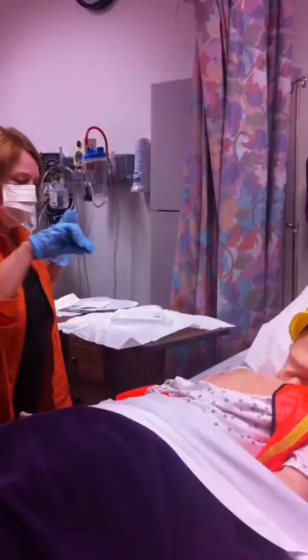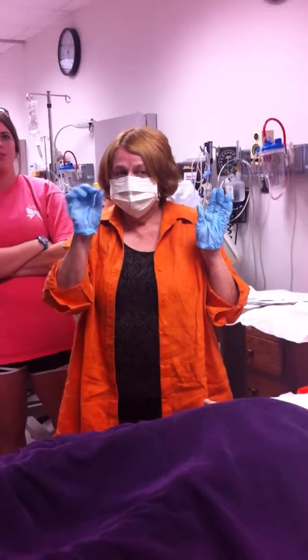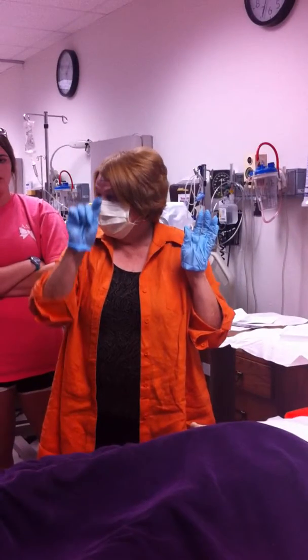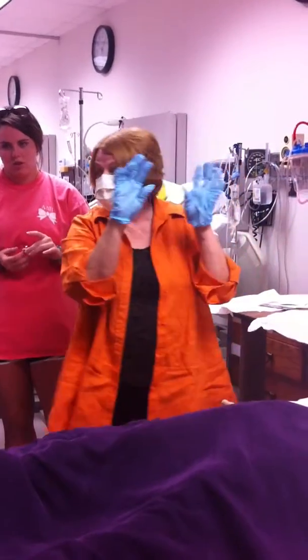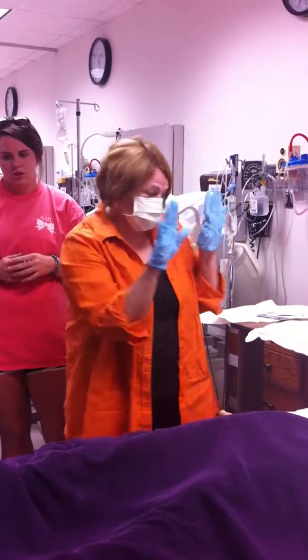And that's going to simulate your antibiotic wafer or that little gauze that has a little slit in it, but you pick it up the same way. You're going to pinch from here. That's the way you should always pick up any dressing material of any kind when you're doing a sterile procedure. Okay?